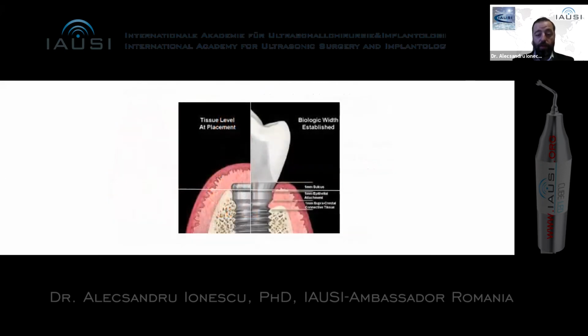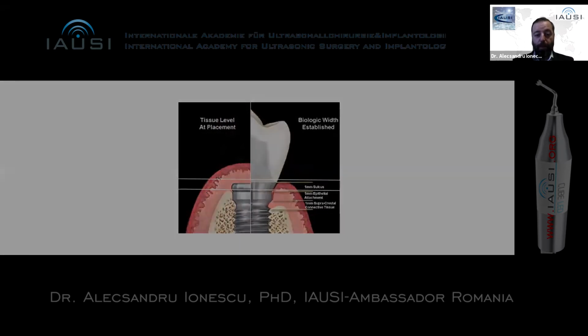So this is one of the reasons that we are preferring the tissue level implants, and also the fact that we are not losing bone around the implant after the biological width is established, because the biological width is respected from the beginning.